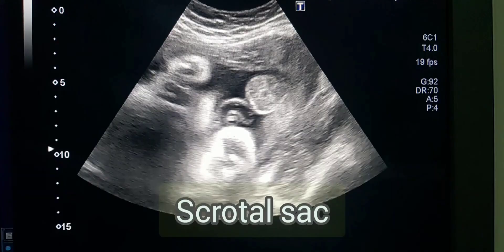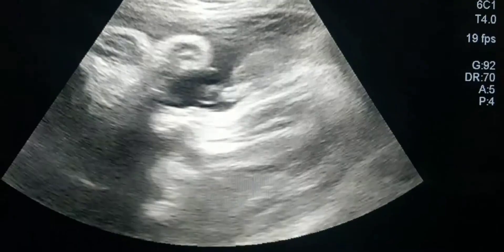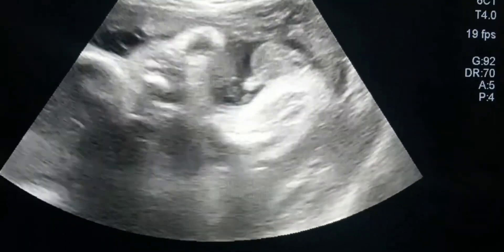Hello everyone, today I will tell you how to determine the sex of the baby confidently. This is a 25th week pregnant female at the end of the second trimester, and in the third trimester you can find easily and confidently tell the sex of the baby 100%.